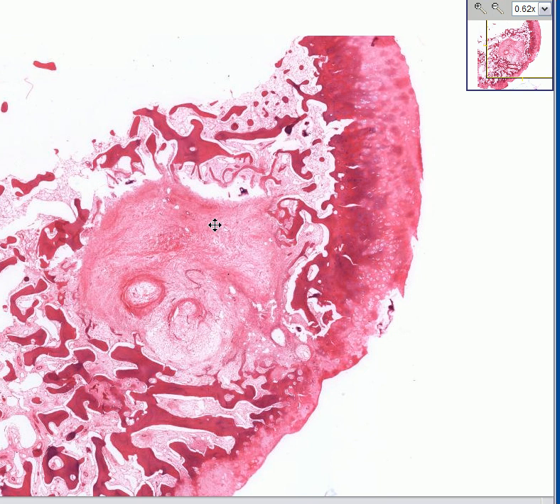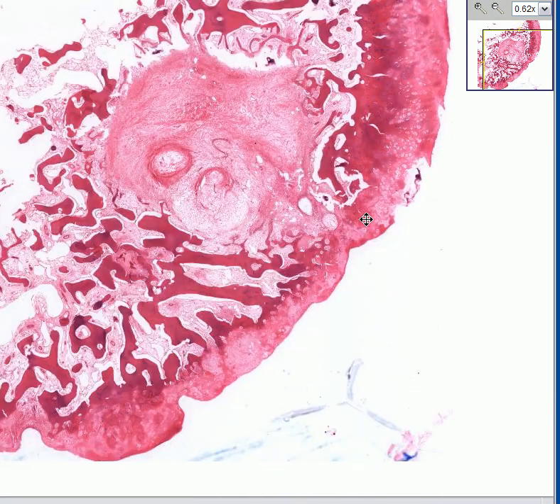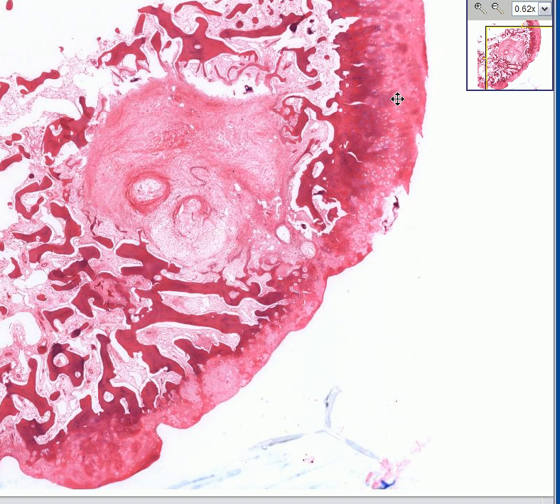Here is the bone itself, and here is something within the bone that looks like there's a loss of bony spicules. You can also see that if this is relatively normal thickness of cartilage along this femoral head, in this area it's very much thinned, and in general it's also very irregular.